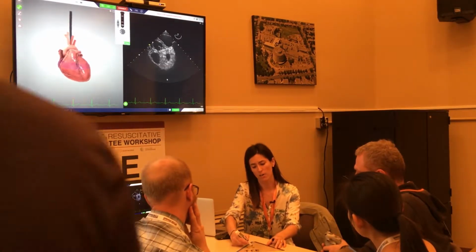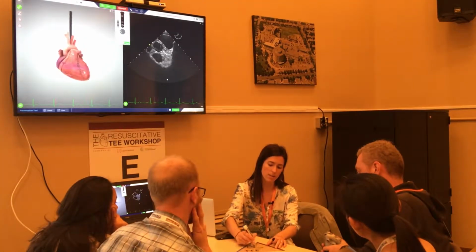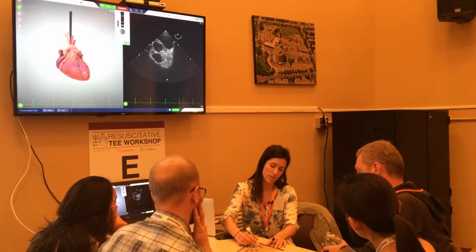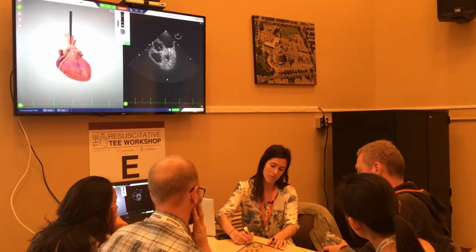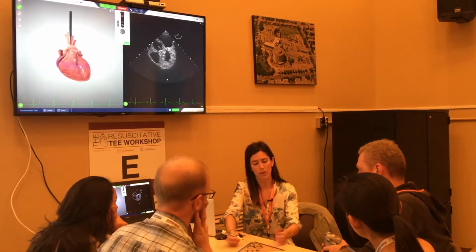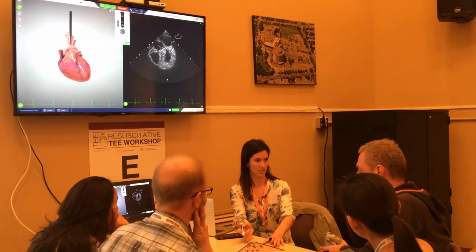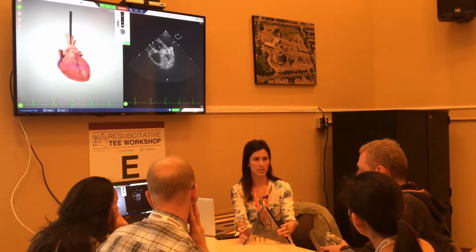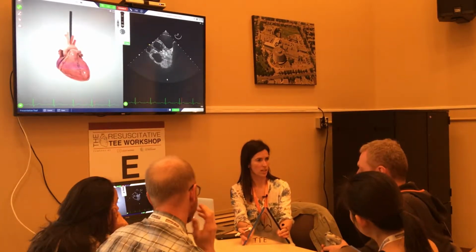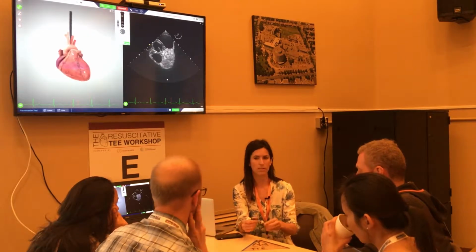Okay, so we have our tricuspid valve here, we have our mitral valve here. And I've had a lot of people say, well, I think we're going to see the tricuspid valve first. It's higher, right? So on TTE, it is a little higher, right? It's located closer to the apex.